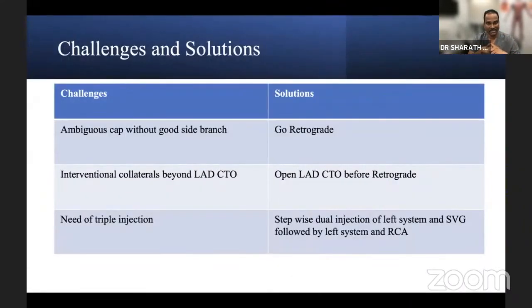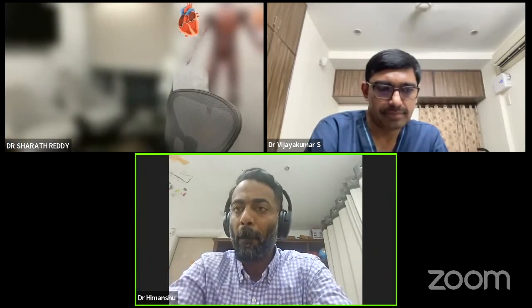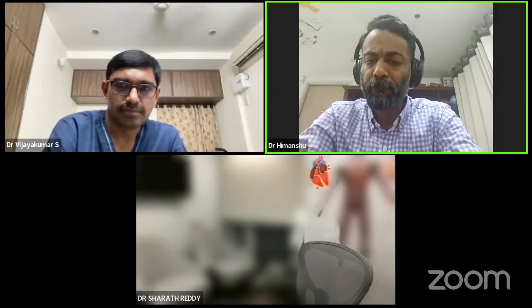So I think these are the challenges which I already discussed, and then we can move on to the live inbox. Comments from Dr. Vijay. I just have a few concerns with a case like this, a patient who's post bypass. With a patent LIMA, you've opened the diagonal, and the circumflex is also not too bad.